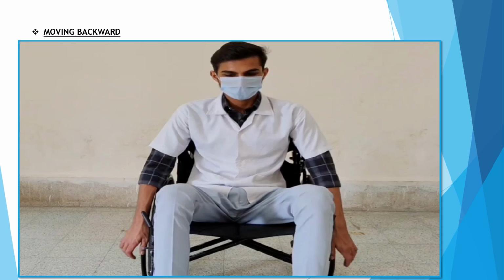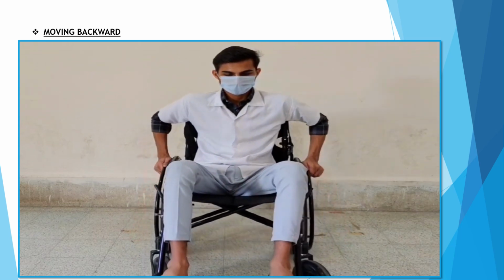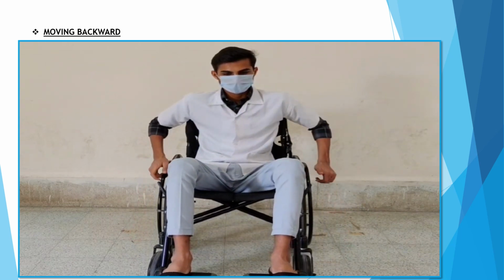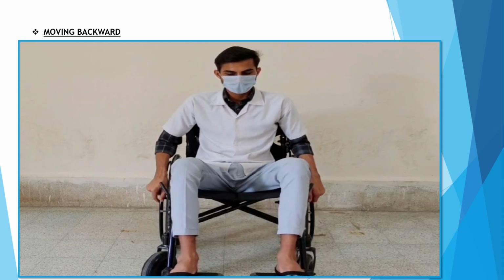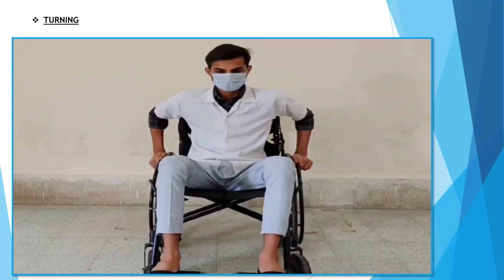Similarly, moving backward can be performed by propulsion of the bilateral wheels simultaneously in the backward direction. The last propulsion strategy is turning.